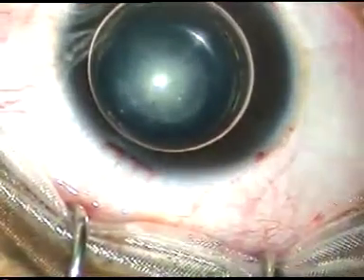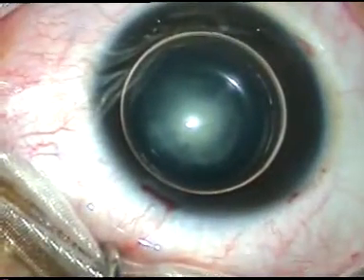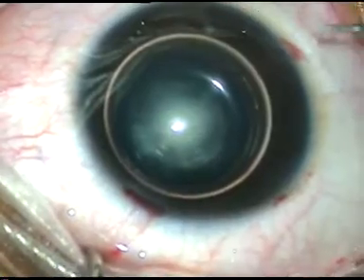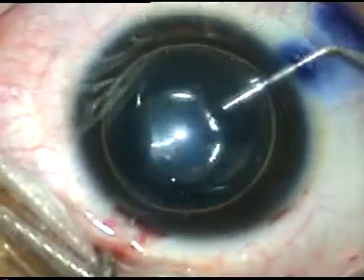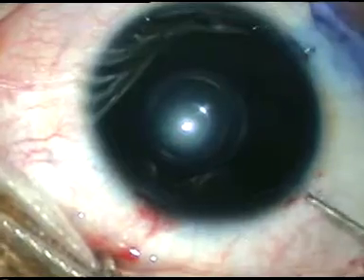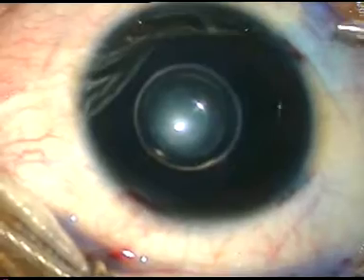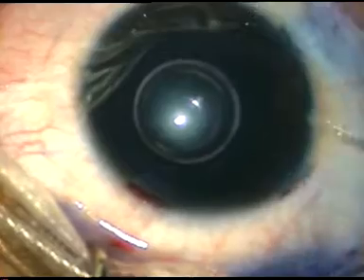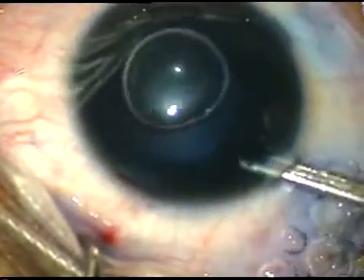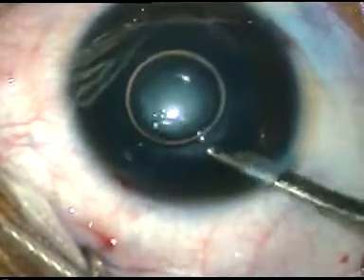The anterior capsule is being stained with trypan blue dye. It has been proved that staining of the anterior capsule changes the elasticity of the anterior capsule and capsulorrhexis becomes easier. A little bit of adrenaline is also being administered and the pupil has dilated well.